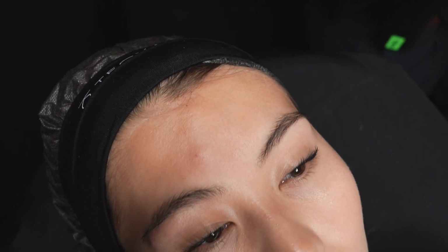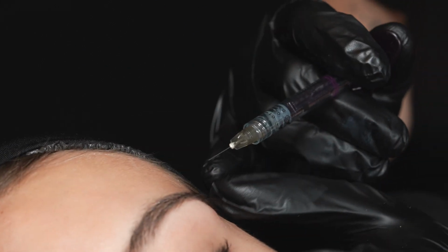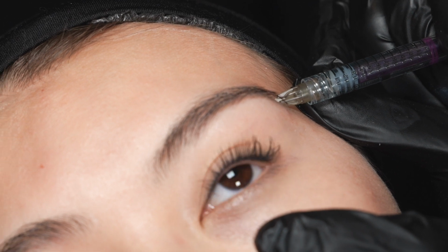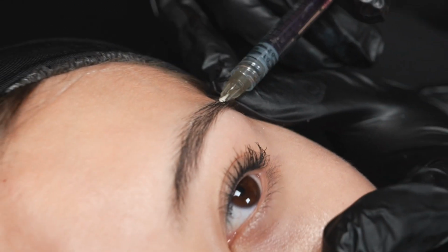Вот сюда надо еще немножечко. Давайте продолжим. Буквально немножечко. У вас асимметрия есть. Поменяли иголочку, нет? Нам длинная игла не нужна, потому что у нашей пациентки плотная кожа. Итак, сейчас я проверил иглу и работаю над надкостницей. И ввожу остаток филлера. Видите, как я медленно работаю?